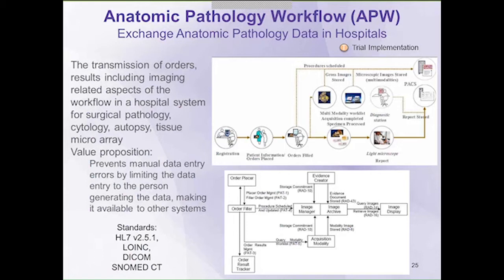I am going to begin by speaking about the anatomic pathology workflow, which is an integration profile that establishes the continuity and integrity of the basic pathology examination with the associated data and images that are exchanged between the systems of various care units or ordering units and those of the anatomic pathology laboratory, and then the back-end systems that are producing, archiving, communicating, or presenting various supportive data or images for anatomic pathology.